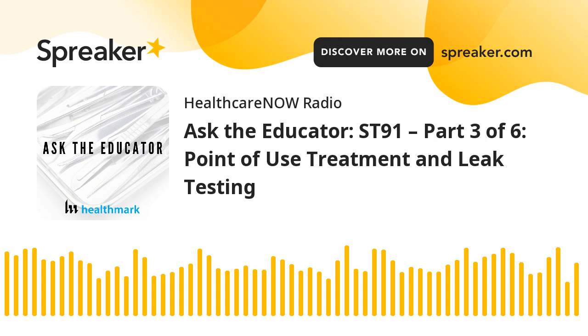So we've stated that every day that they are in use, leak testers need to be quality checked to make sure they're delivering the correct PSI. Some of the automated ones do it every time you turn them on. You need to look at the instructions for the automated ones and see if that is the case. If not, and for the handhelds and the others, there are options available to check the pressures, the PSI coming off of these leak testers.